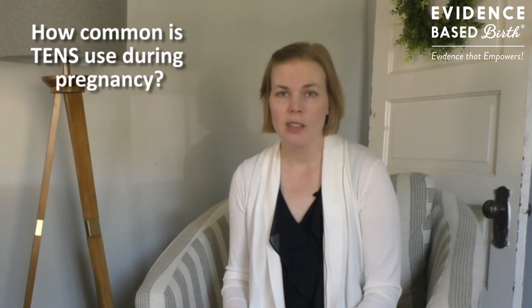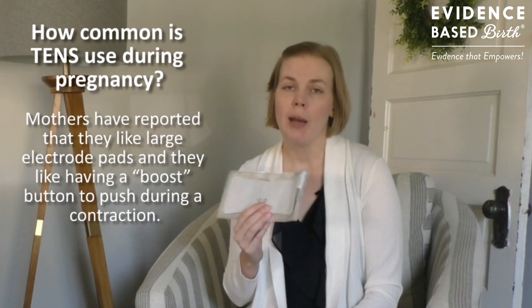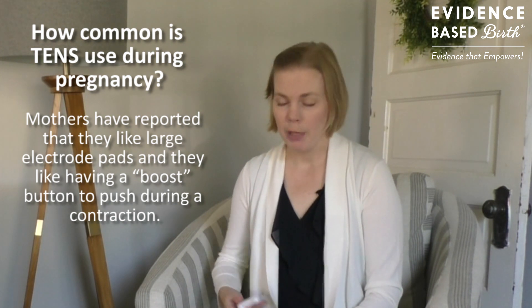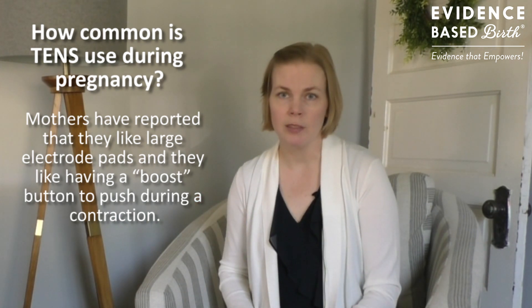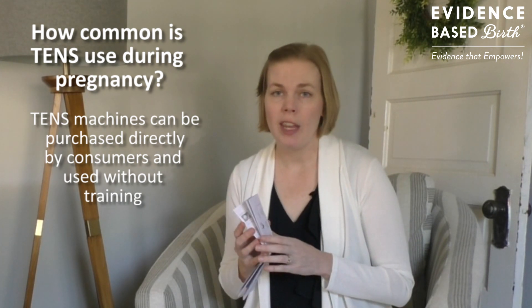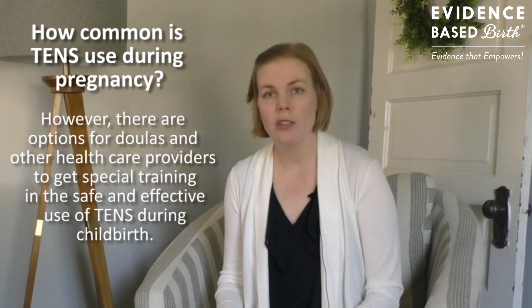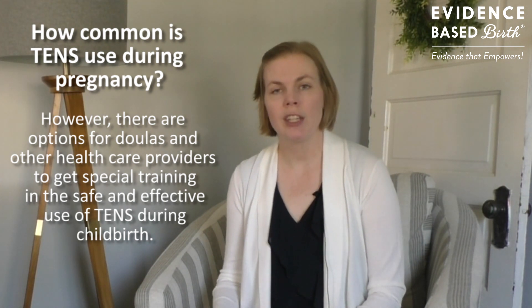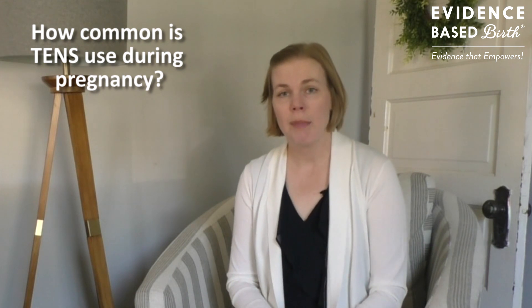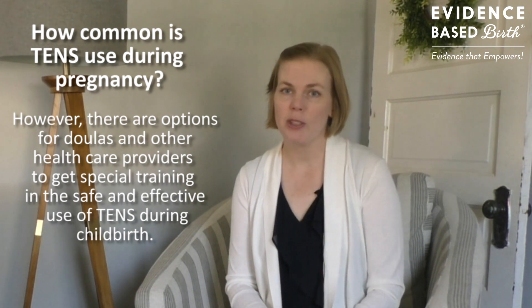There are a variety of different types of TENS units available. Mothers typically report that they like the larger pads because labor pain is a little bit more spread out, especially if they need it on the back. Mothers also report that they like having a boost button they can push during labor — the TENS unit I purchased does not have that button, but there are some on the market that do. TENS can be purchased without a prescription. It can be used without any special training other than reading the safety insert, though there are options for doulas and other healthcare professionals to get formal training. In the research, TENS was often applied to the lower back without special training, but in some studies a trained acupuncturist applied it to special acupuncture points.